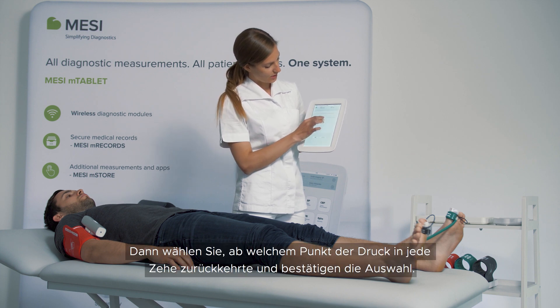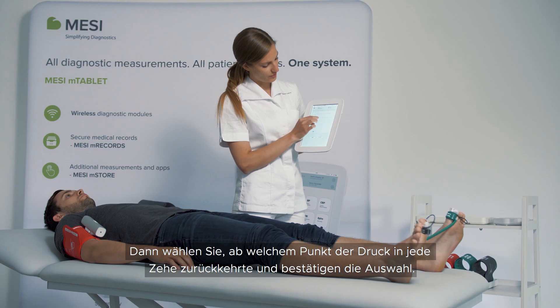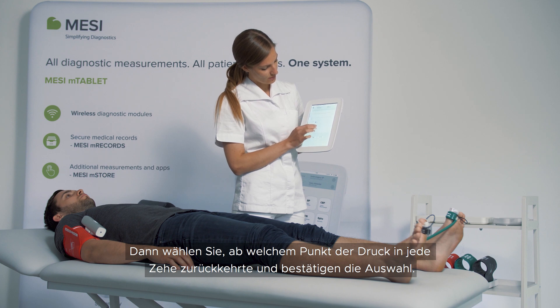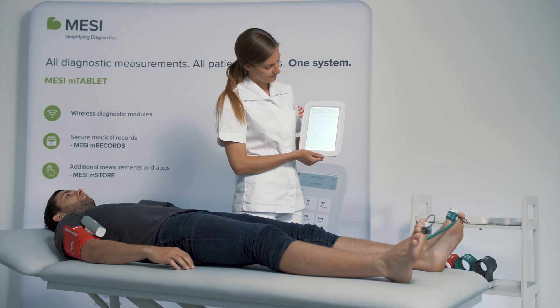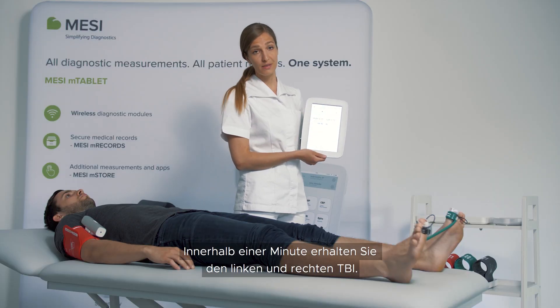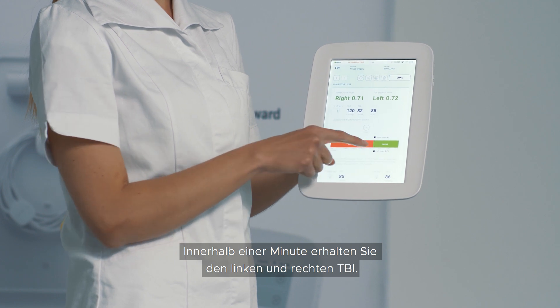Then you can choose at what point the pressure returned for each toe and you confirm. In a minute you receive the left and right TBI, the toe brachial index.